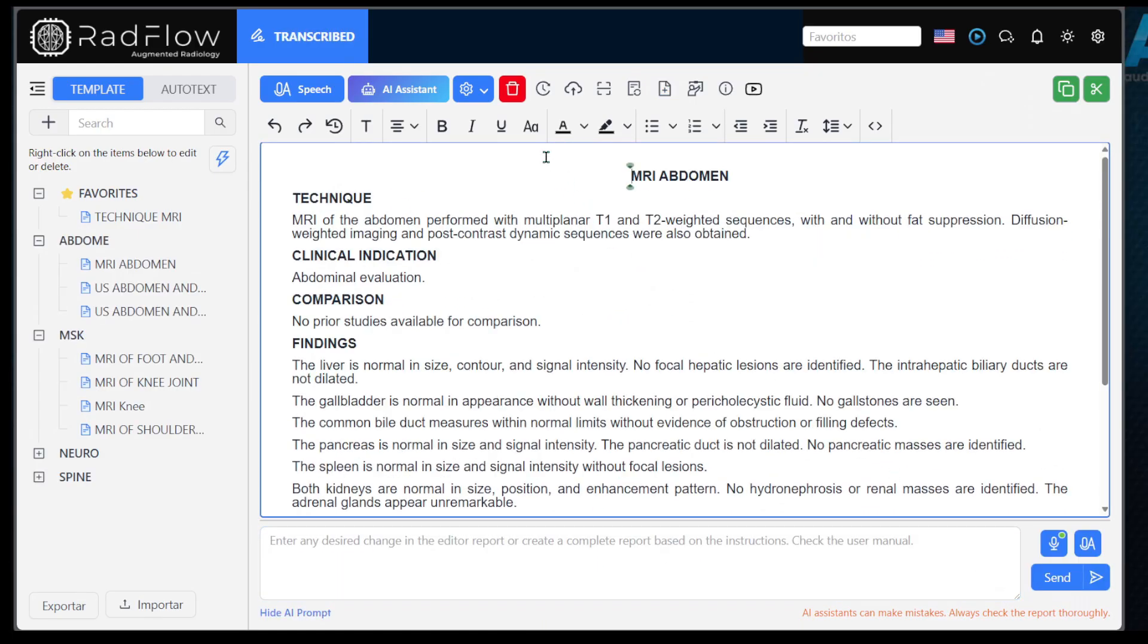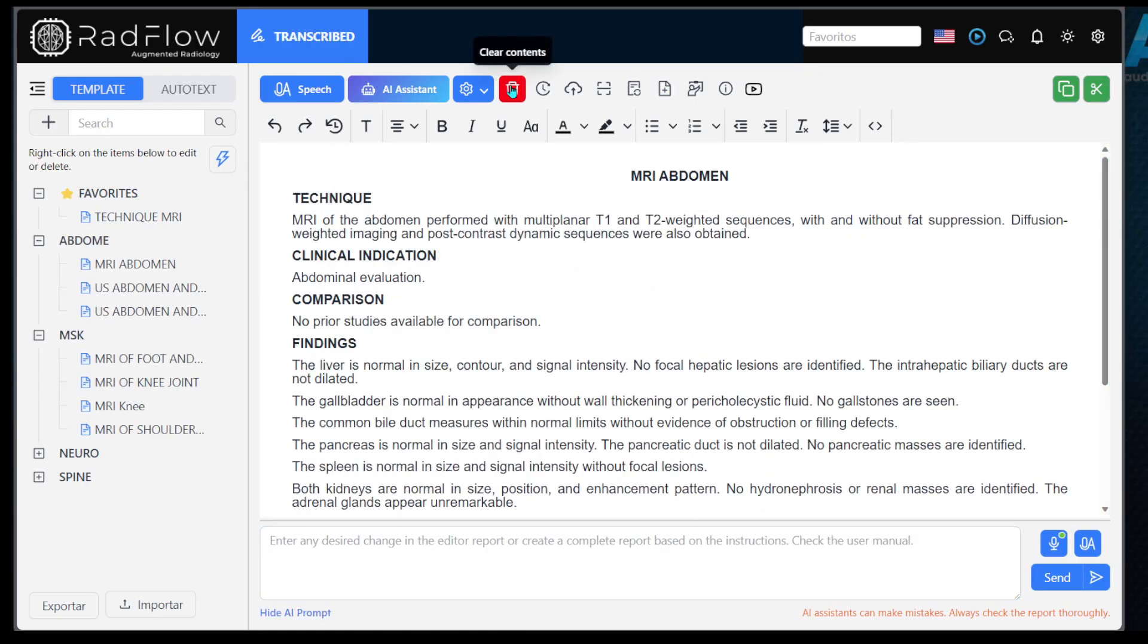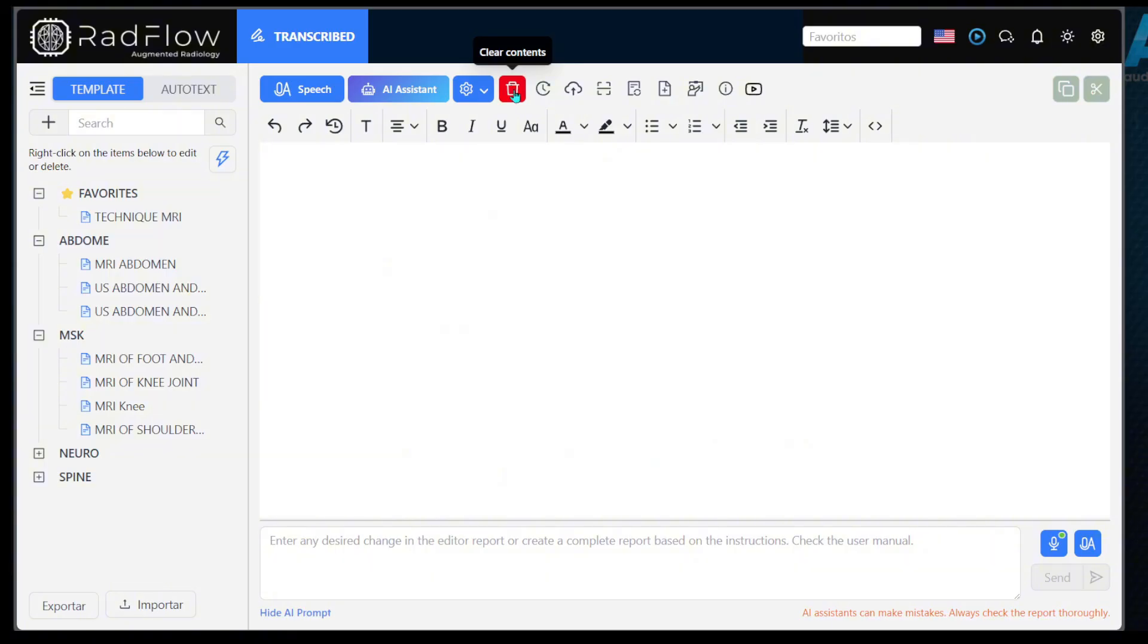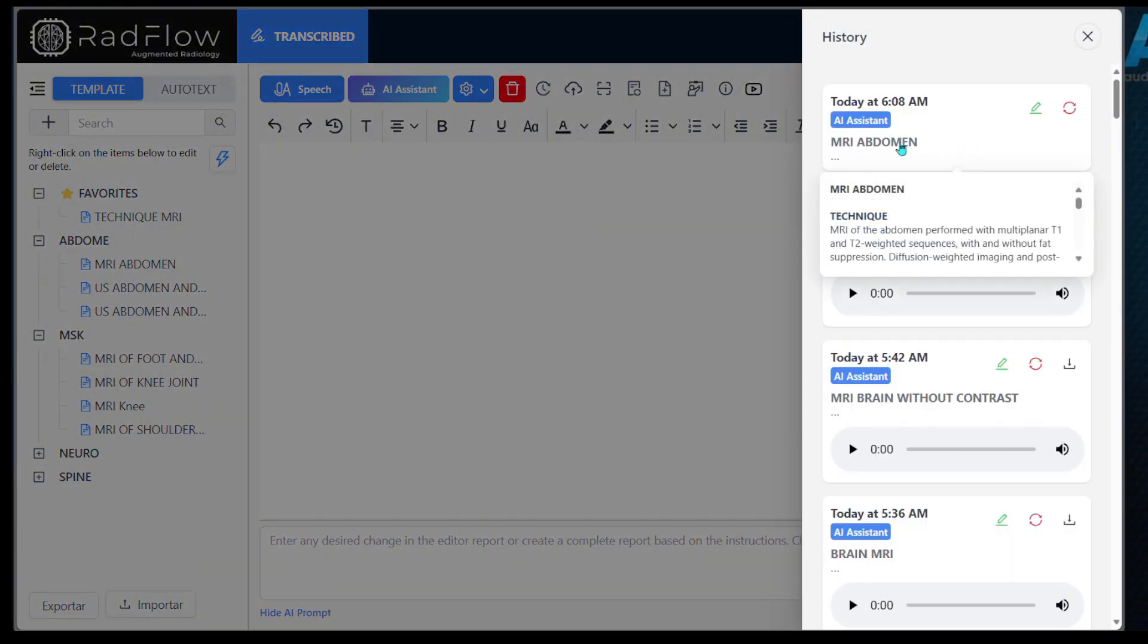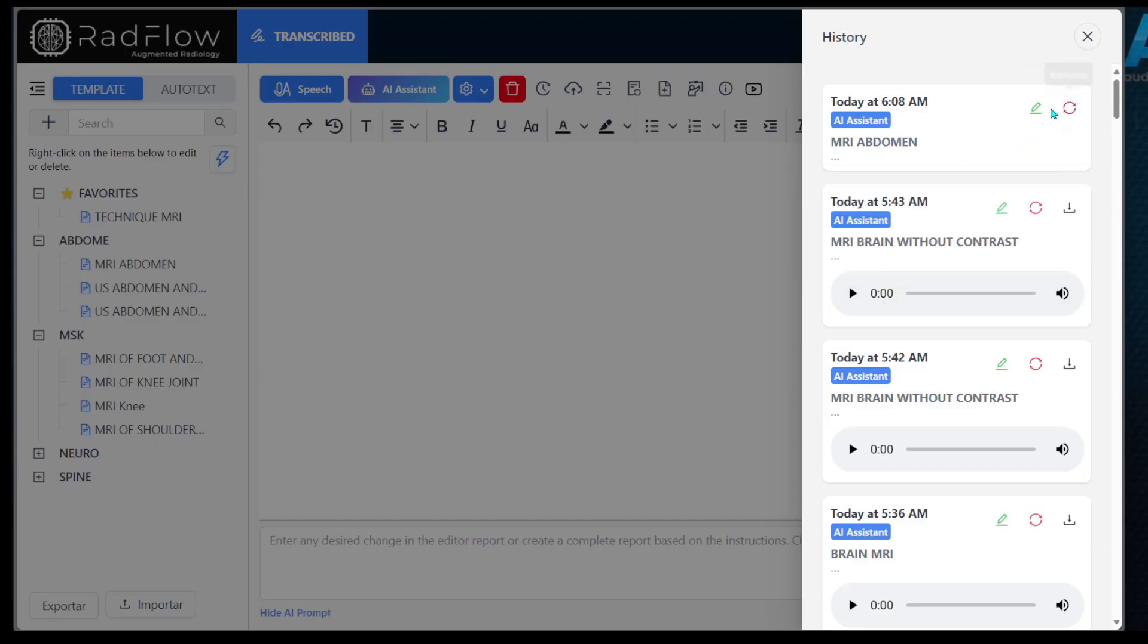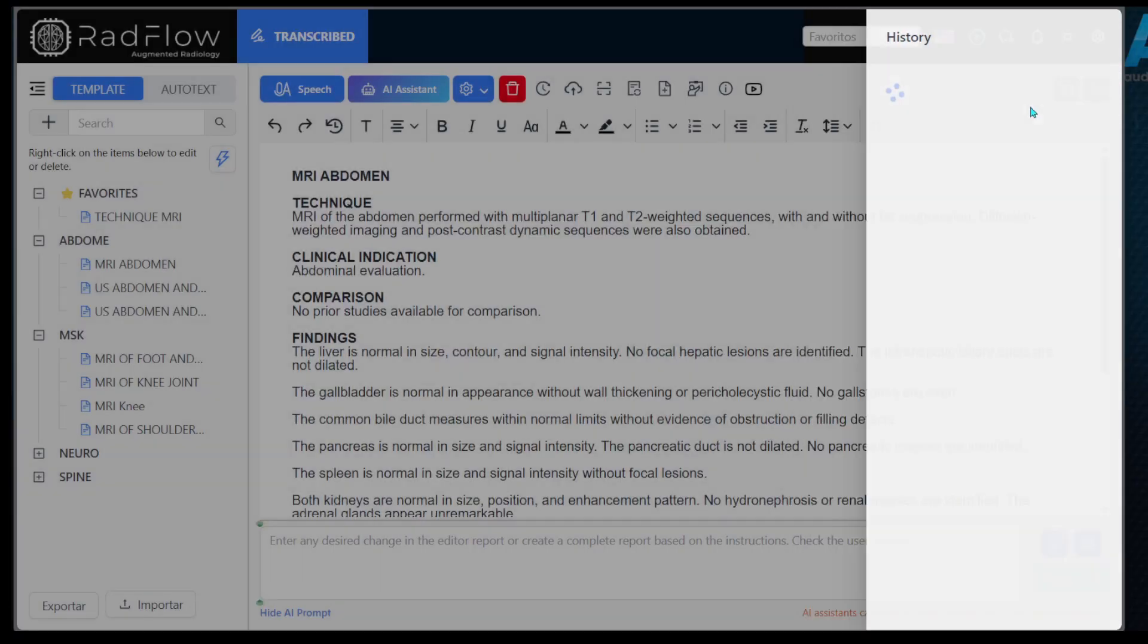Finally, it is very important to know about the history button, which allows you to recover previous reports. If there is any internet instability and a report is not saved correctly, you can restore it using this option.